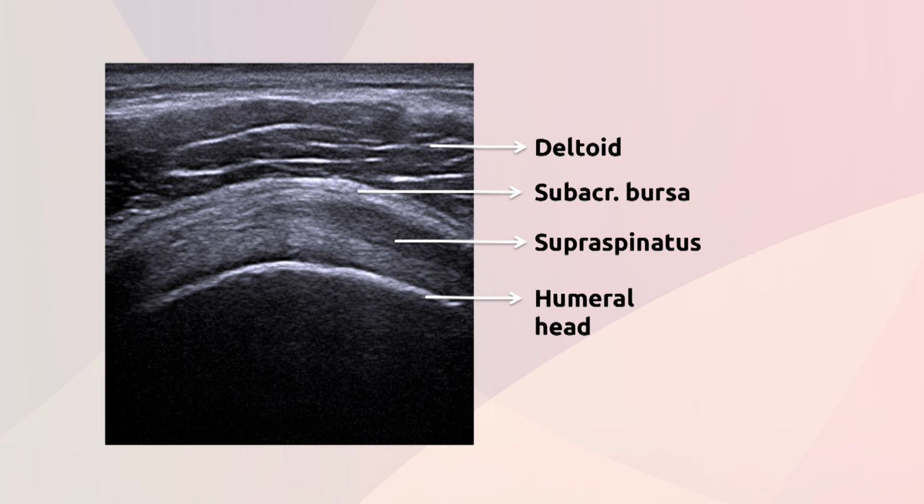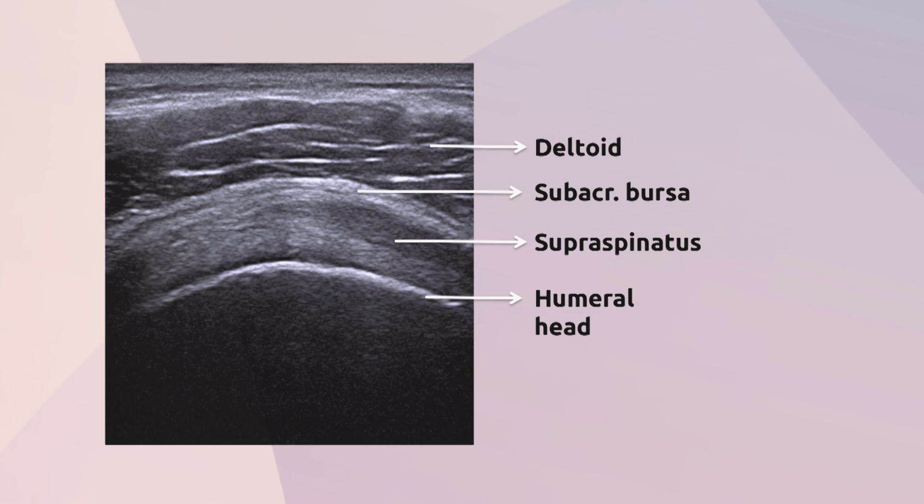I can show you hundreds of different anatomical structures and even more pathologies, but let's keep it clear and simple. Let's focus, as an example, only at several normal, everyday pathologies of the supraspinatus tendon. On this slide, a healthy transverse supraspinatus is presented. Please memorize this picture. An accurate diagnosis is not that simple due to the complexity of the anatomy and biomechanics of the human body.